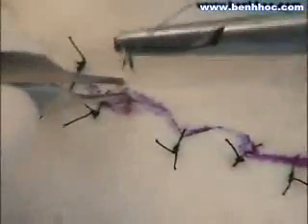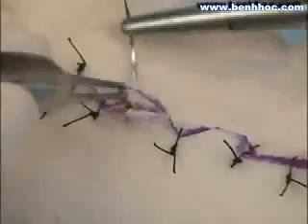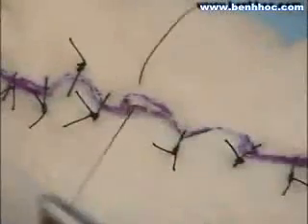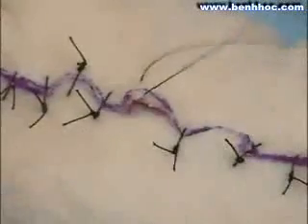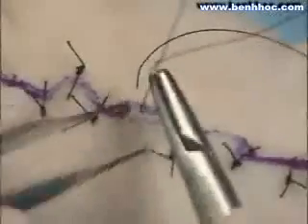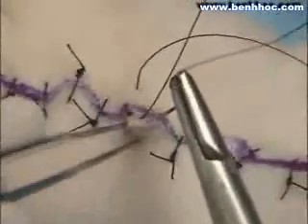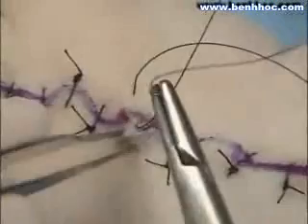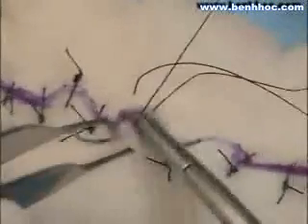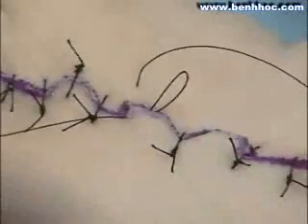Here's a closer view showing the introduction of the simple sutures to close the geometric broken line closure as a technique or method of scar revision. Here we can see in this particular example the corner suture is being placed so that it does not interfere with the blood supply of one limb of the flap.